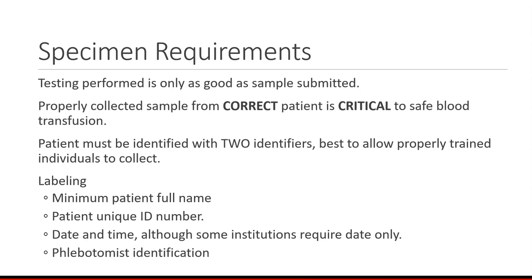My biggest horror story is my first job was in a very small hospital, I don't know, 60, 70 beds, and I received a cross-match order for a patient. So I went and collected it, verified their name, their ID number from their bracelet, went back to the lab, I typed them, they were AB positive. Well, in our little bitty transfusion service, we didn't have AB positive blood. I had to special order it.